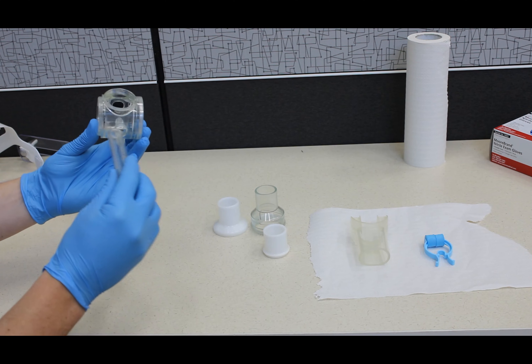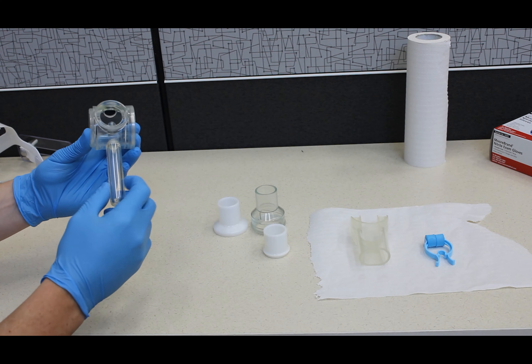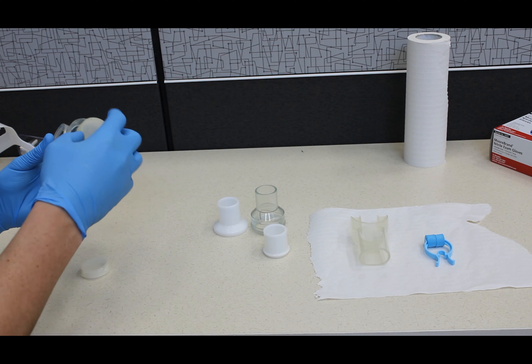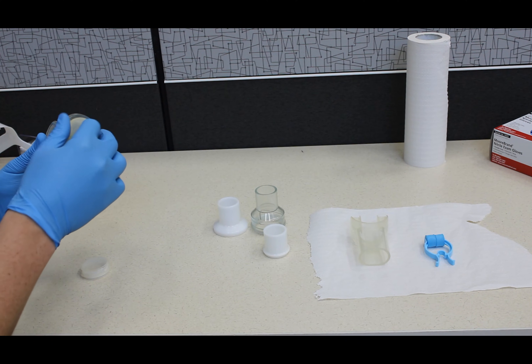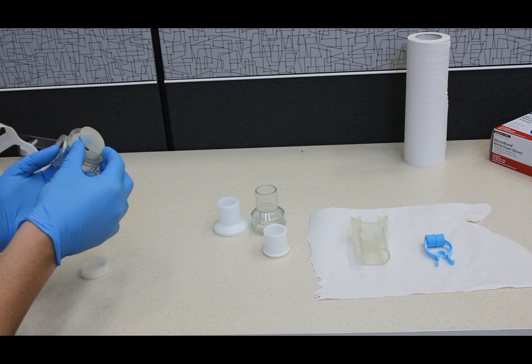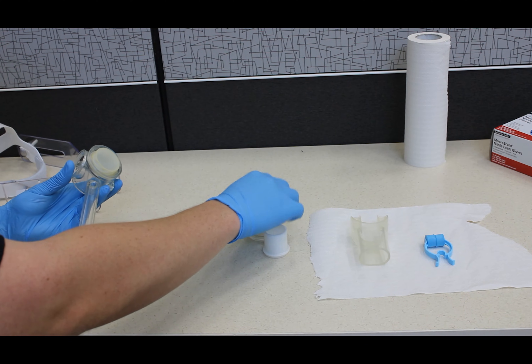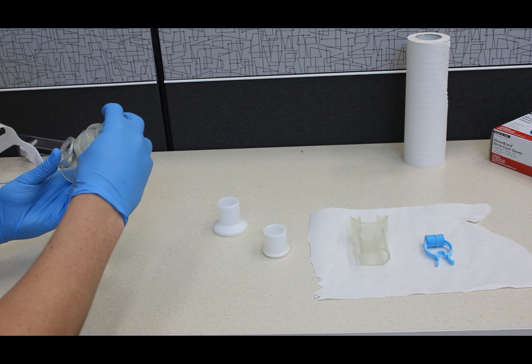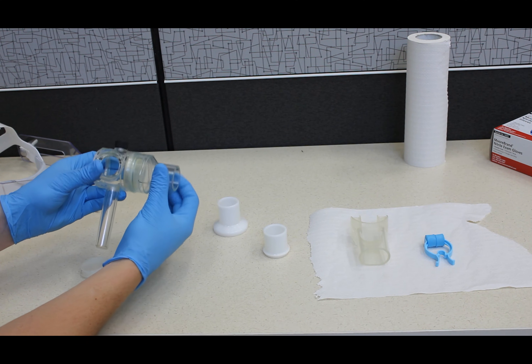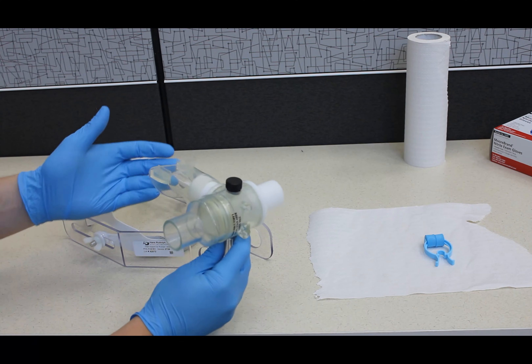Take the main body and fit a one-way valve into the side, then screw on the inbound connector to the other side of the main body. Push on the valve to make sure the rubber part presses in. This ensures that the airflow will be able to circulate throughout the mouthpiece and allow the participant to breathe normally through their mouth. Next, attach the mouth connector to the main body, then attach the mouthpiece to the mouth connector. Now you can attach the assembled mouthpiece to the headpiece.